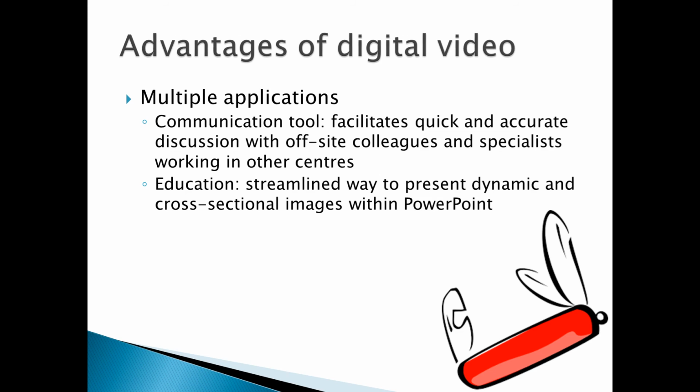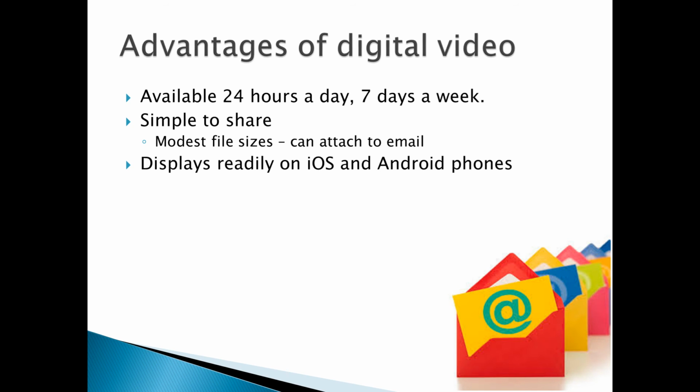To recap the advantages of digital video, it has multiple applications as a communication tool to facilitate discussion with off-site colleagues and specialists working in other centres, and as an educational aid, a streamlined way to present cross-sectional and dynamic radiology within PowerPoint. It also has other advantages. If you are able to create video, this facility is available to you 24 hours a day, 7 days a week, without relying on services within the hospital.